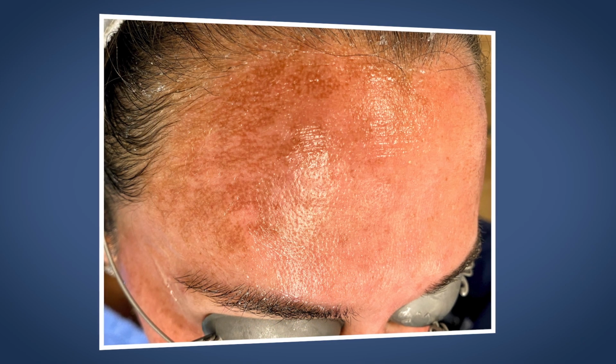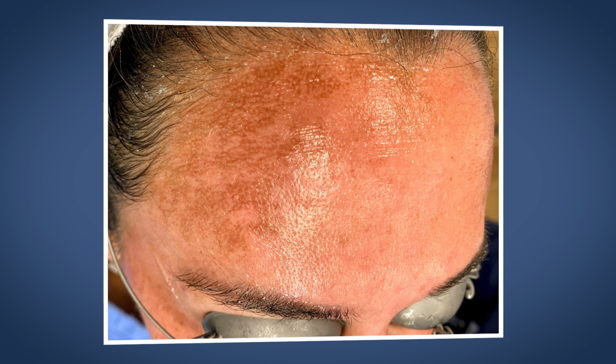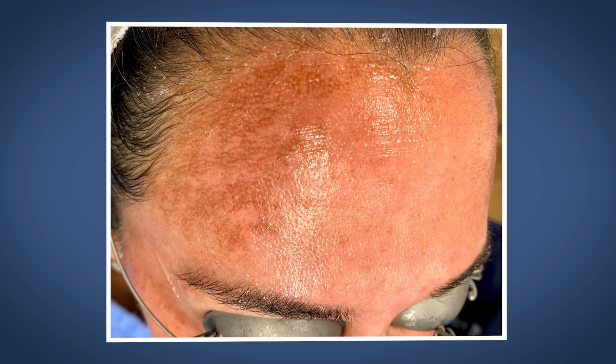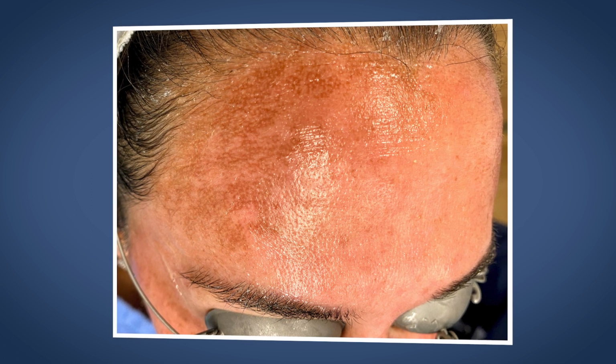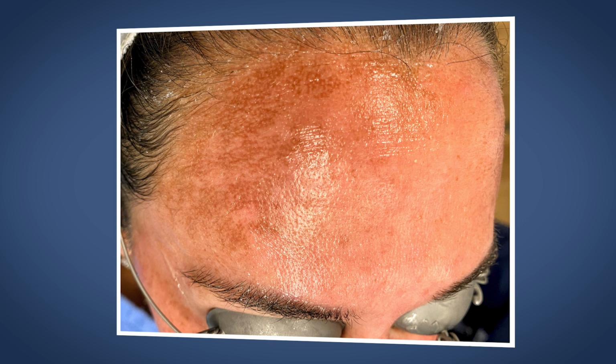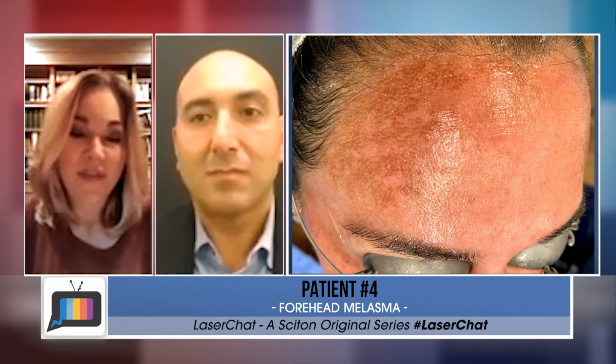Well, I agree with you. There definitely looks like there's potentially some melasma going on here, and taking a look at the patient with the Wood's light would give us some idea of the depth of this pigmentation. I've been really impressed with just the simple 1927 wavelength, so Moxie potentially, but if I did think it was a melasma issue, I would probably be less aggressive with my Moxie and talk about more treatments rather than less.